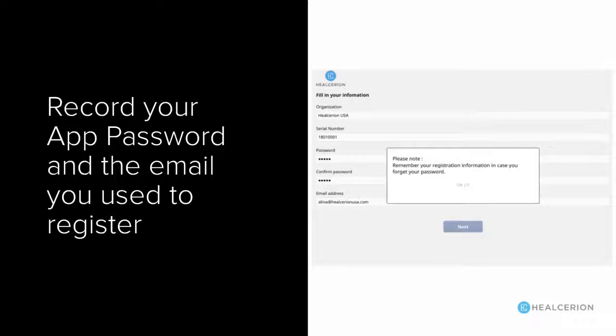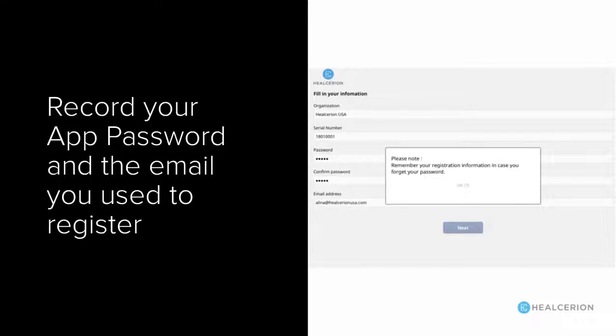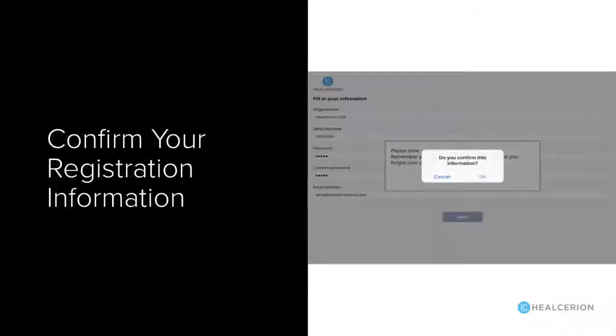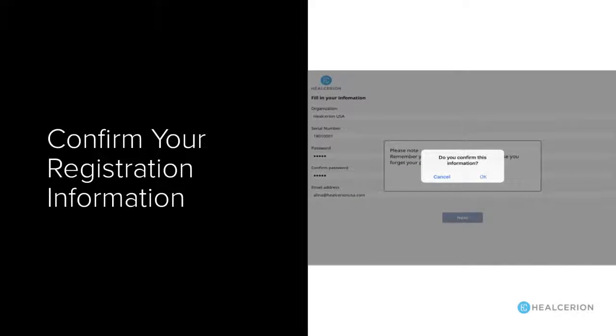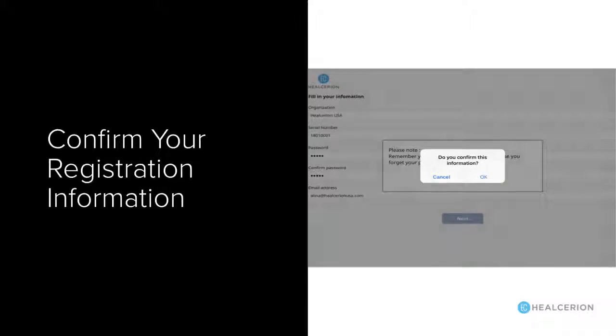You'll also need to create a password for your app. Once you're finished, you can go ahead and confirm all the information.